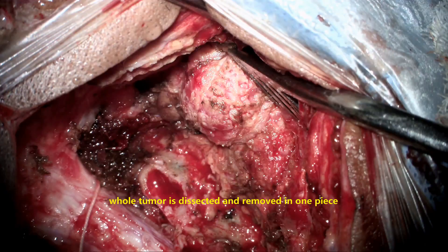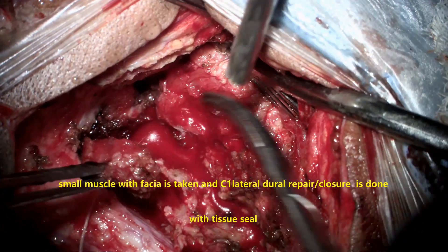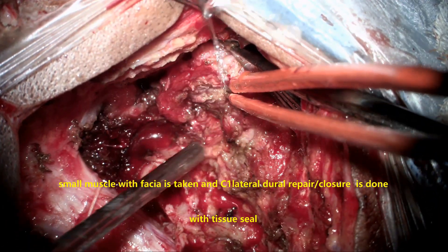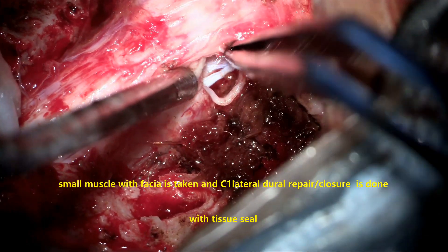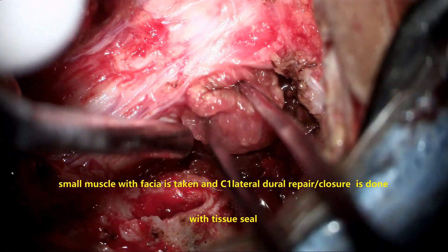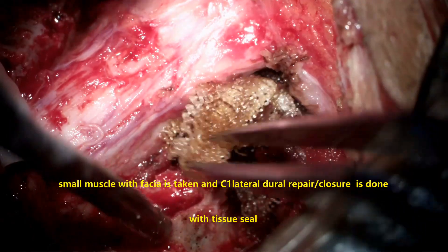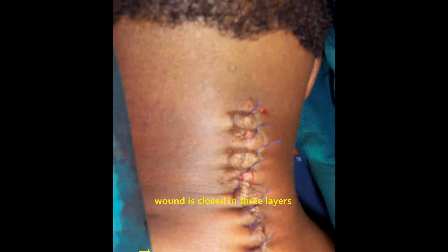Once complete removal is done, this is the end stage of surgery. The dural defect created to extract the intradural tumor component is repaired by taking a small muscle with fascia from the deeper layer of the neck muscles and using it as a graft. The entry point where the tumor was entering the dura is visible along with normal nerve roots and the lateral aspect of the spinal cord. The approximately one-centimeter defect is sealed with the fascia-muscle graft and tissue sealant to prevent postoperative CSF leaks. Absolute hemostasis is achieved; on both sides the tumor is taken out completely, the cord is pulsating well, and the wound is closed in three layers.